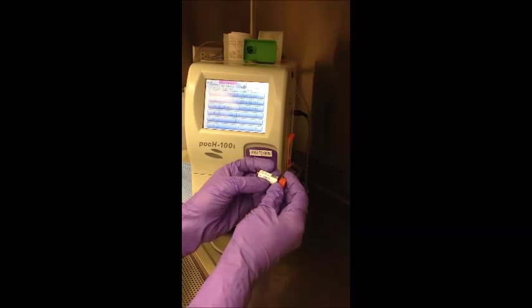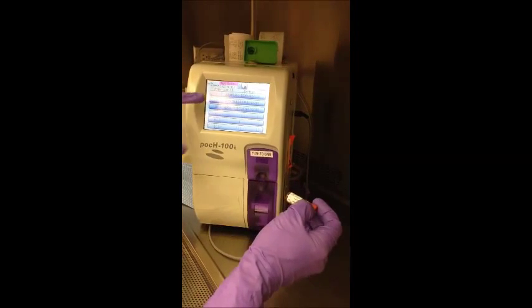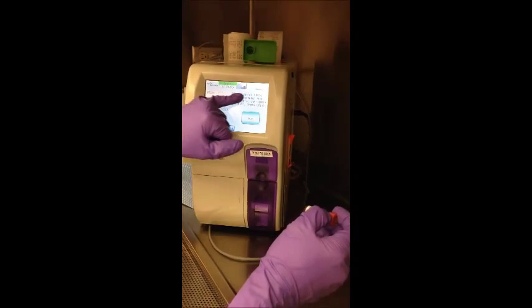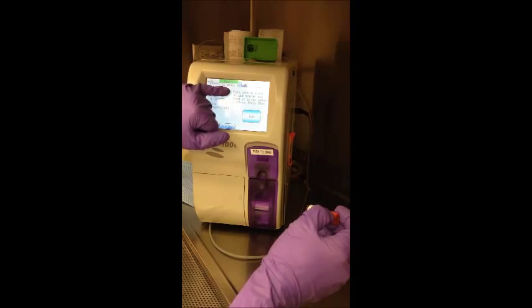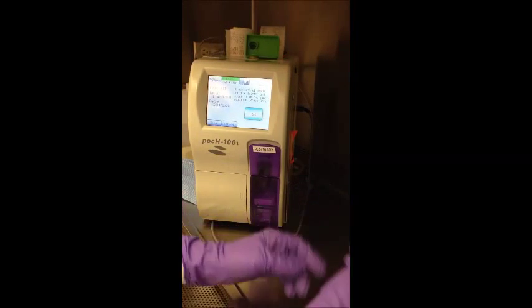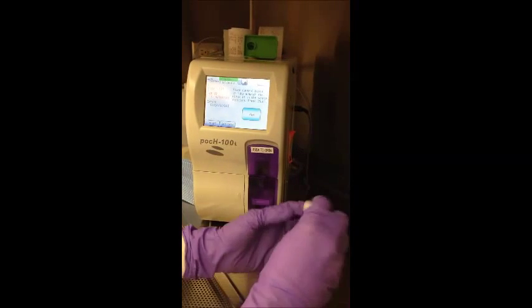This is 42590710, which is the first one. I'll press on it. And here are instructions. Place control blood in tube adapter and place it in the sample position. Press run. So I'm going to mix the vial.